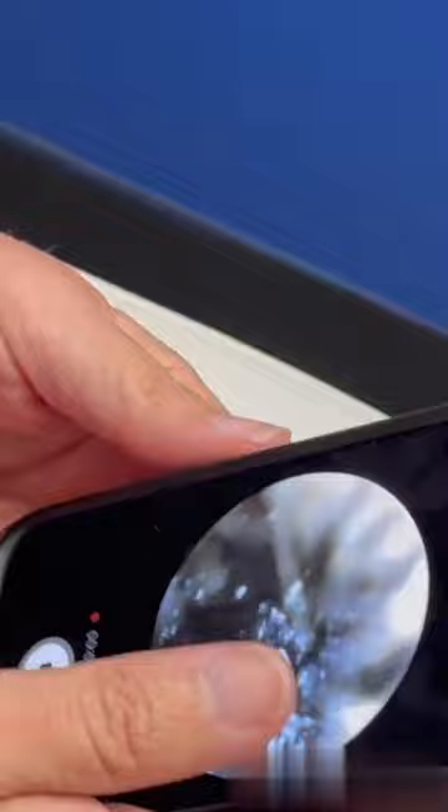I'm going to show you how to do this. The proper way is you're going to look in the ear with your non-dominant hand. You're going to pull the ear out just slightly so the canal is straight, and then you're going to go straight in like this.